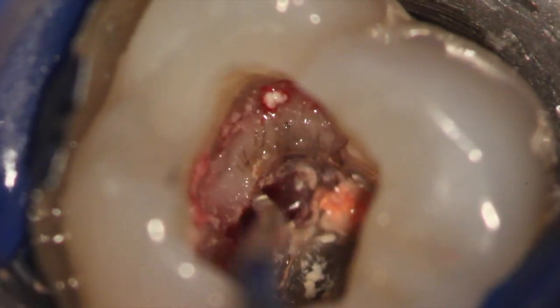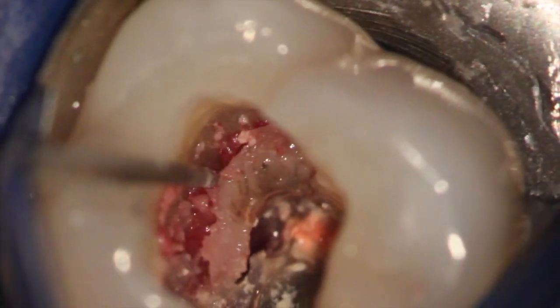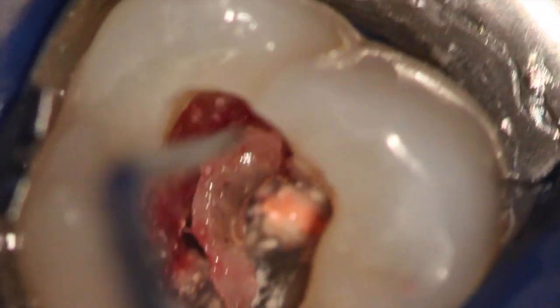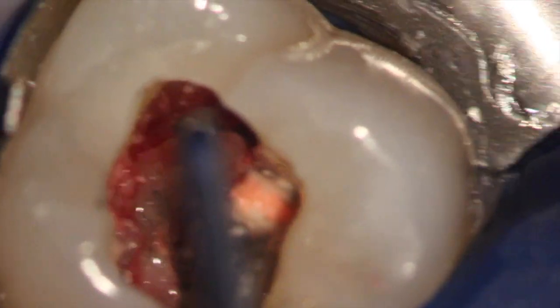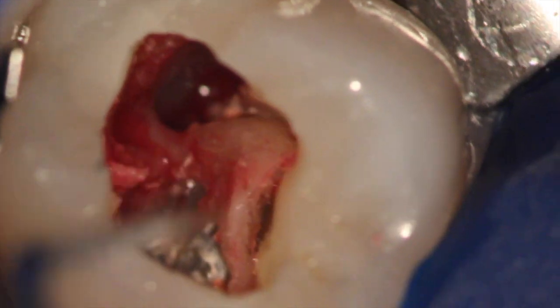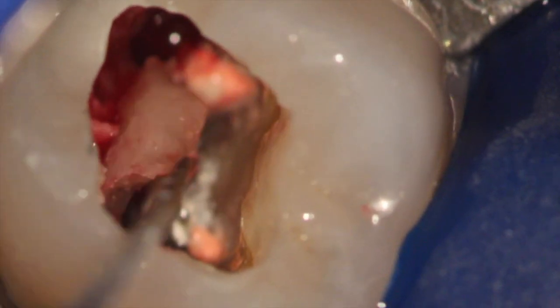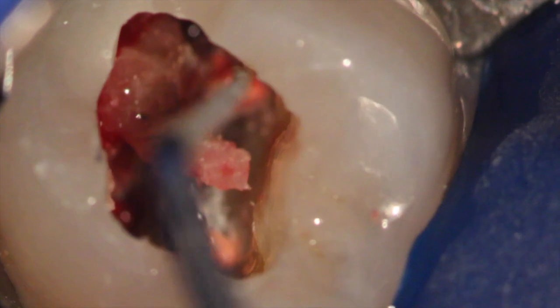It kind of flicks away, and you can see in the video I use the Endo Explorer DG-16 under high magnification to flick away some of the structure that's there, which is kind of loose already — and it was pretty amazing to see. You just flick it away and it's attached to some soft tissue, with some bleeding. The bleeding eventually stopped.